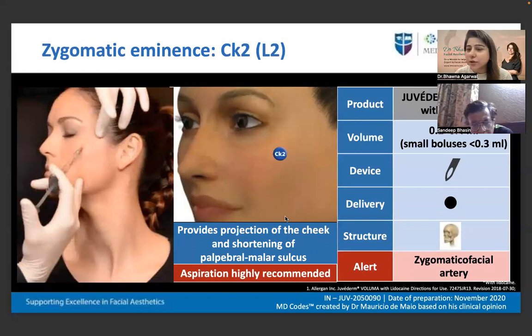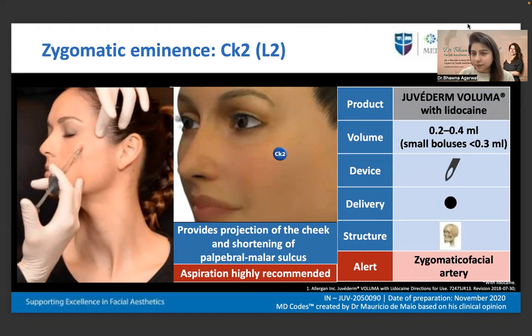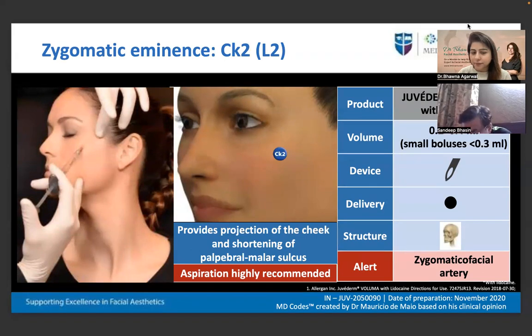Then the second point is CK2, the zygomatic eminence. Again, the product that we use for this is Voluma. We do the minimum dose here, 0.2 to 0.4 ml, in small boluses. The device is needle, delivery is bolus, and on the bone, supraperiosteal. This is a point where models apply highlighter so that they can get a better picture. This point makes the face more photogenic. So in a young patient, they'll get good results.